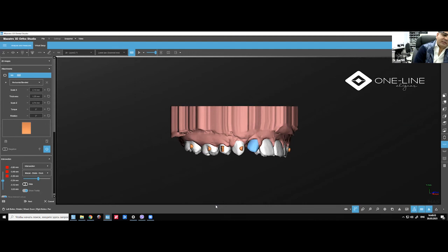So this has two problems. One, it's a very small tooth, which is not good. The good part here is that it has enough surface area on the mesial and the distal part, which is very good. So you have to get the movement done, which means that you need movements here mesially, here distally.